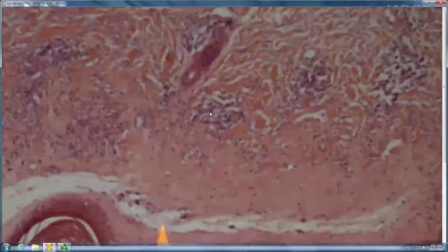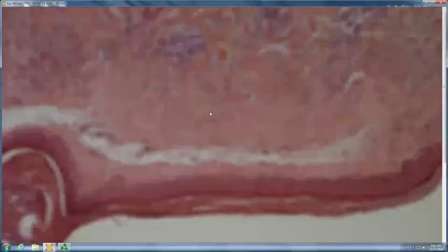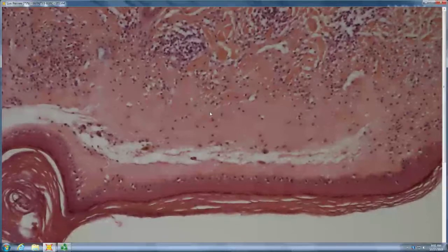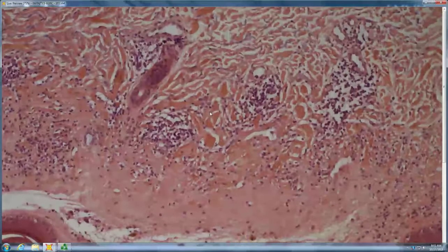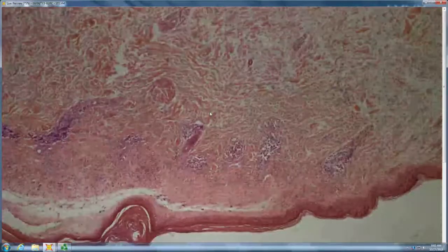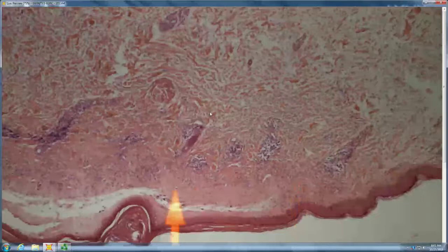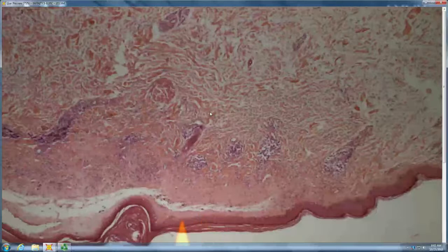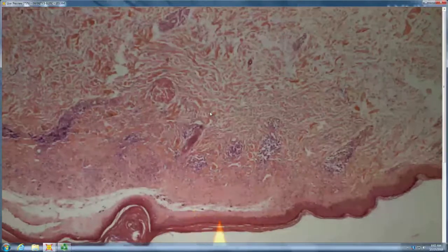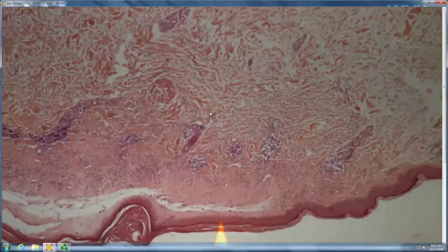Atrophic epidermis. How about your keratin layer? Some hyperkeratosis. So hyperkeratosis, atrophic epidermis. How about your dermis? Looks kind of hyalinized. Some might say sclerotic. And then there's a band, a lymphoid band. So this is LS&A because you noted the atrophy. If it's not atrophicus, then you just say LS, right? Because some of it, especially vulvar, is very hypertrophic where people scratch it and rub it.